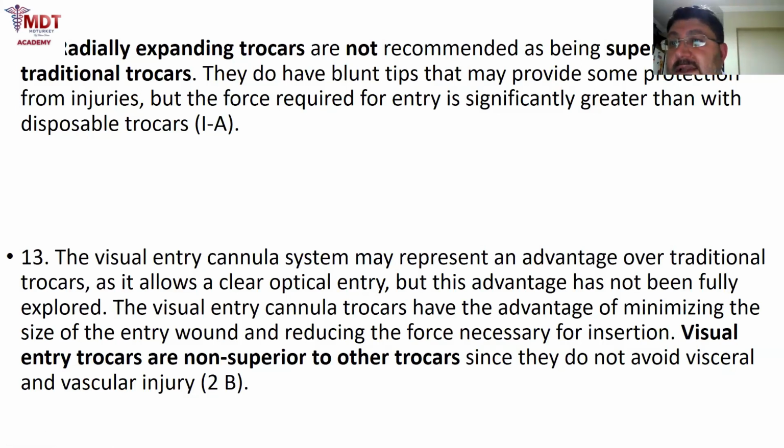Again, I am telling you that I am doing open laparoscopy. For me, it's the safest way to reach the peritoneum, and I don't believe those reported complication rates because they are not the real rates, because nobody is reporting his or her complication rate. They are the rates of the advanced laparoscopists. I think that the complication rate is higher than these numbers.